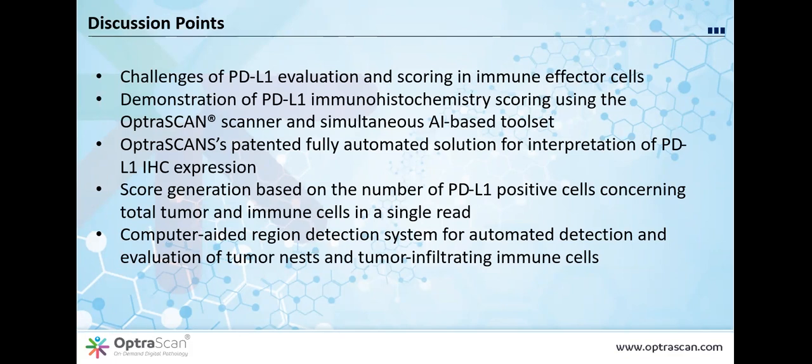OptraSCAN's patented fully automated solution for interpretation of PD-L1 IHC expression. Score generation based on the number of PD-L1 positive cells concerning total tumor and immune cells. And lastly, the computer-aided region detection system for an automated detection and evaluation of tumor nest and tumor infiltrating immune cells.